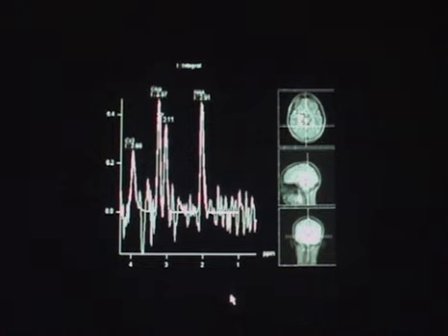That being said, it is important to realize that these techniques can be somewhat difficult in the area of the basal brain, where the skull base can cause a lot of magnetic field inhomogeneities.